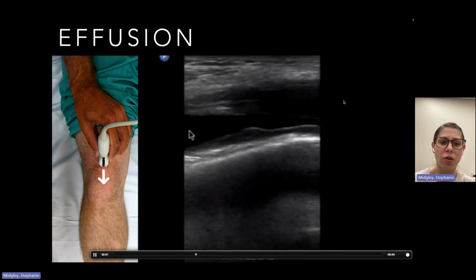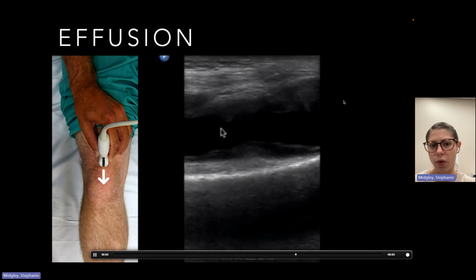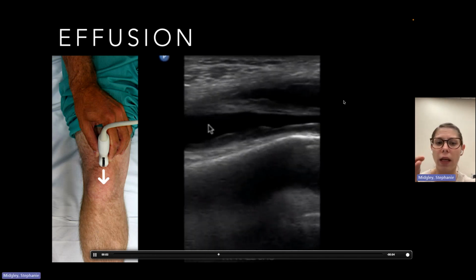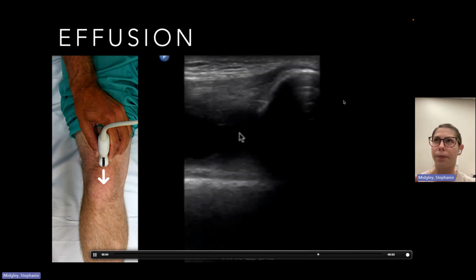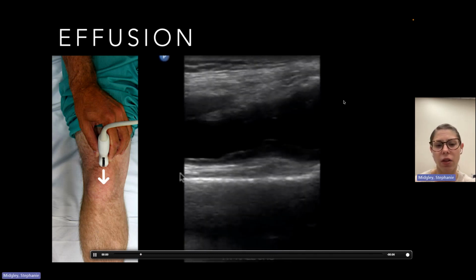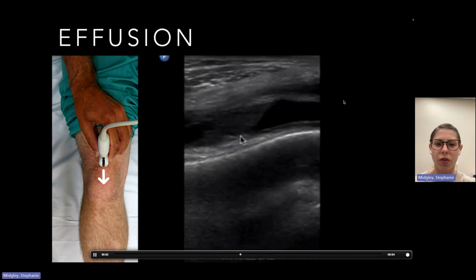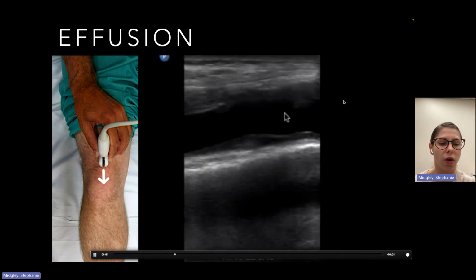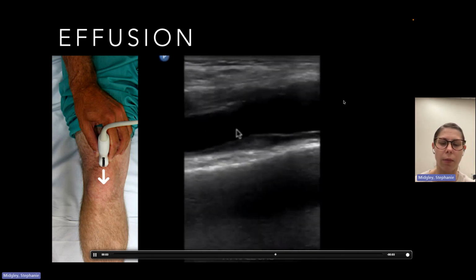They've done studies trying to look at the characteristics of the effusion, the rind thickness of the synovial lining, and whether there is complexity in the effusion, trying to figure out if it's septic versus arthritis versus gouty, and nothing has been proven sonographically. So the only way to tell is actually to sample it.